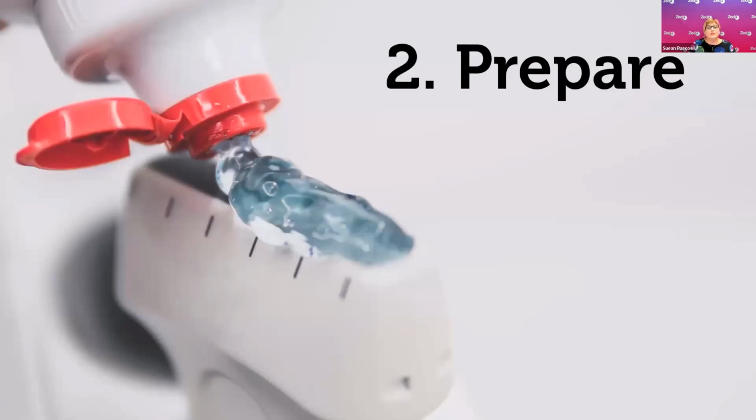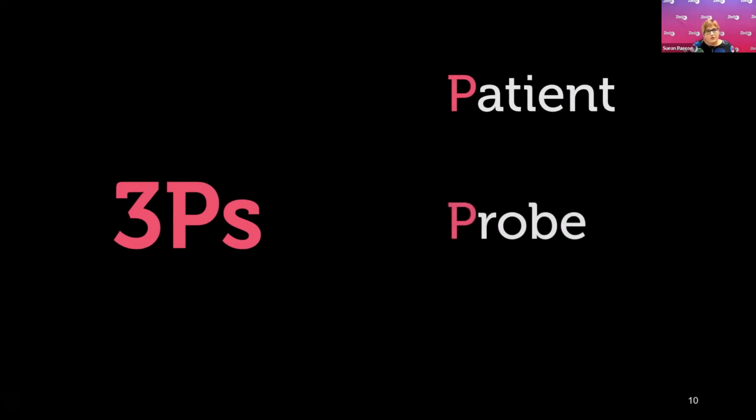Now, the next step we're going to do is to prepare for the scan. We're going to remember the 3 Ps. So we're going to pop the patient details into the ultrasound system. We're going to choose the right probe for the job, and we're going to choose the right preset.